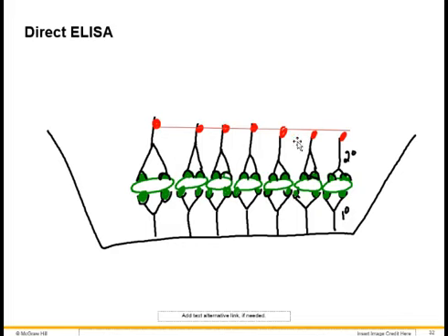And if they have a color tag to them, if it's not an enzyme but a lateral flow test, they'll have these antibodies all lined up, and they all have this pink or red or whatever color tag attached to them. And several of these antibodies all close together will cause it to show up as a line. And so you get a red line in our group A strep test. This is how it worked.